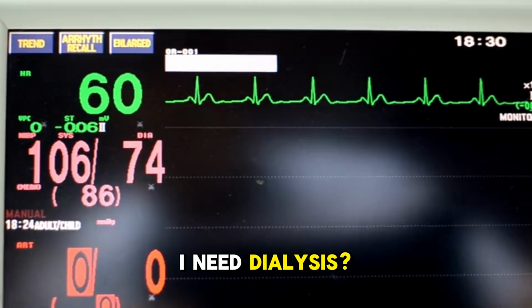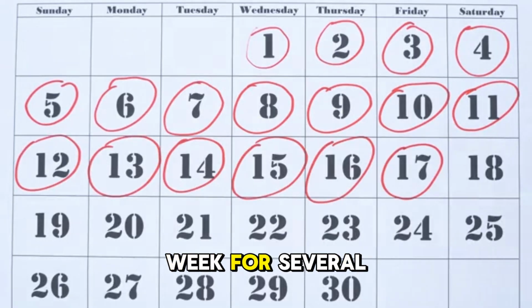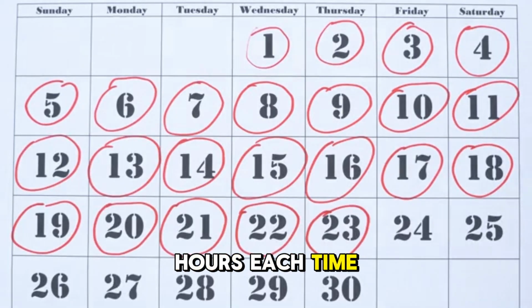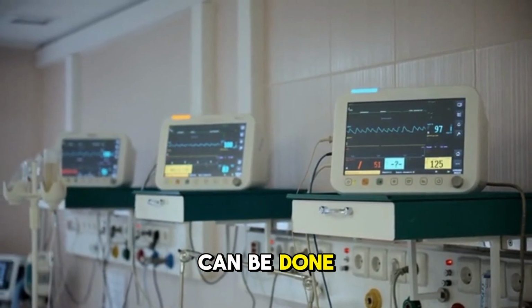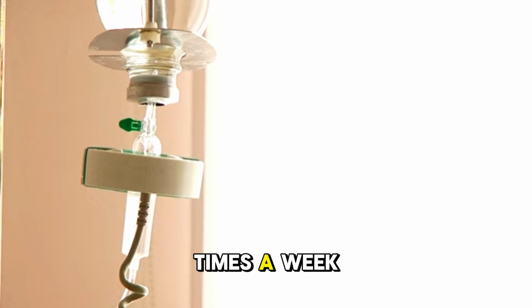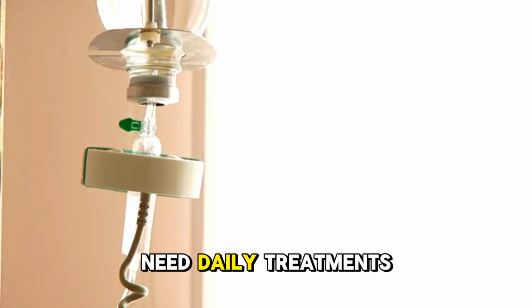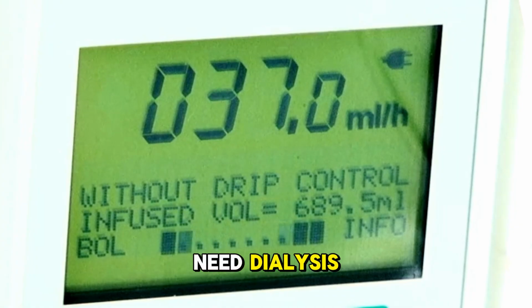How often do I need dialysis? You may need dialysis several times a week for several hours each time. Dialysis can be done through the use of a machine, or it can be done manually. Most people need dialysis at least 3 times a week. Some people may need daily treatments. Your doctor will determine how often you need dialysis.